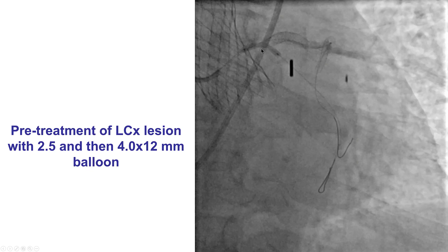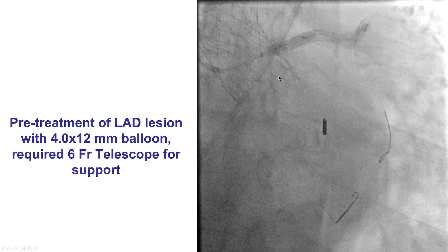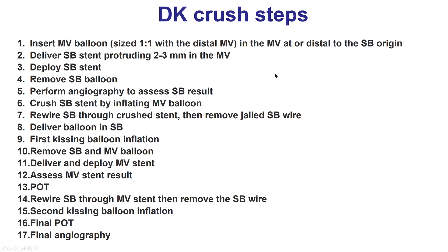The first step was to do intravascular imaging, which confirmed that the patient had neointima and that the stents were actually well expanded to start with. We decided to first predilate — we predilated the circumflex and then the LAD, which had a good result and the balloon expanded very well. We then decided to do the DK CRUSH. In many cases with two layers of stent we do not want to place an additional layer, but this was the exception because we did not believe we could get a good result given the extensive disease in the LAD as well as the left main.